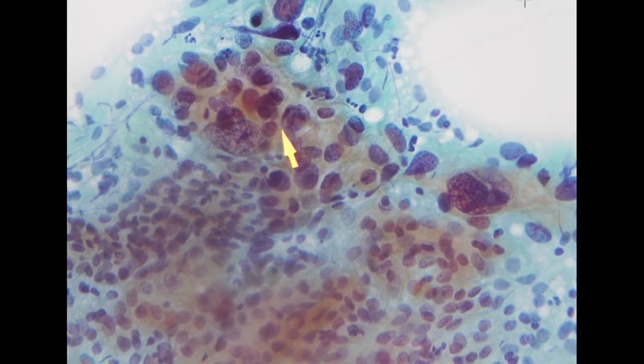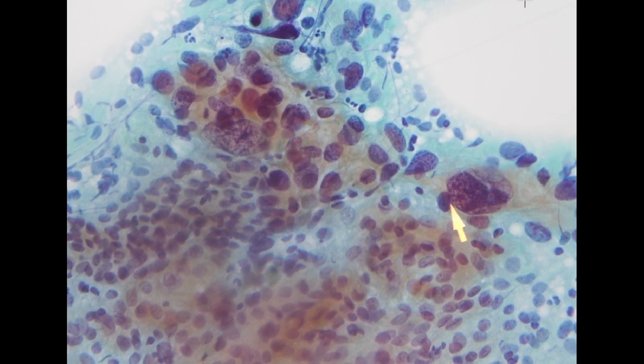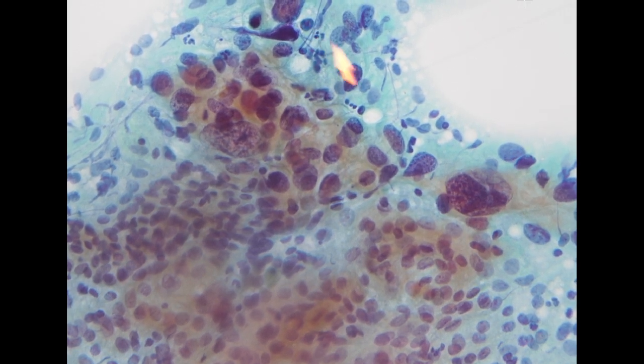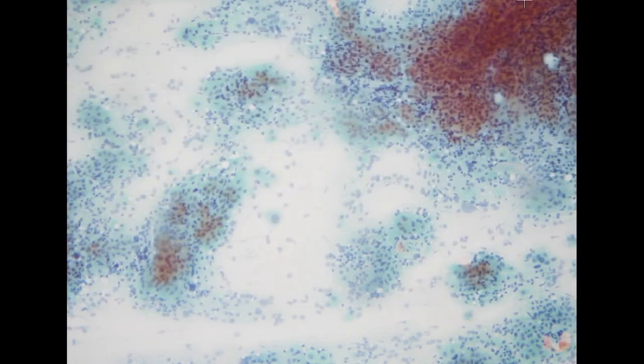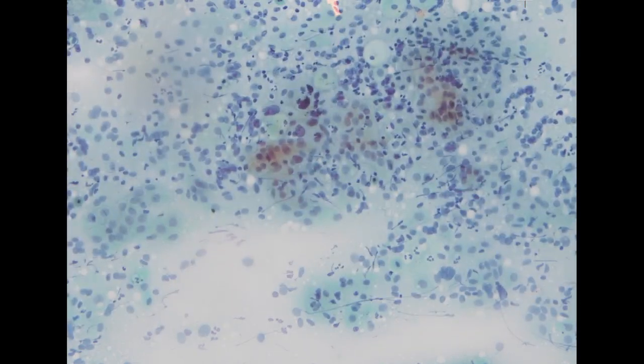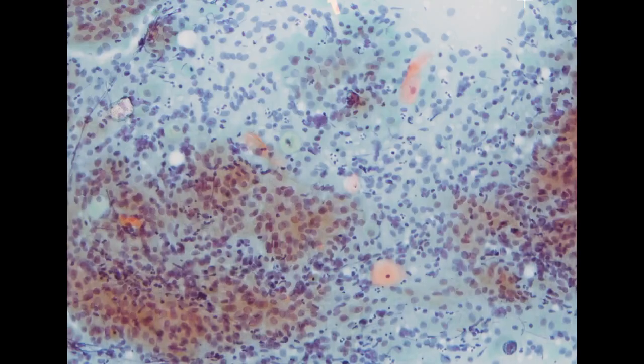And if you check the NC ratio, you didn't see an increased NC ratio, or a sharp membrane that you can tell is an increased NC ratio. So you find these areas scattered around the entire smear, which is a common reactive change for atrophy.